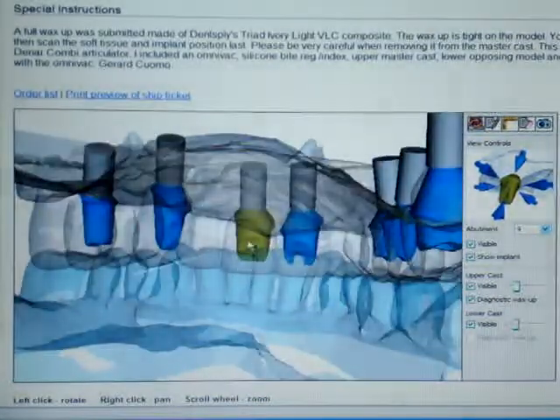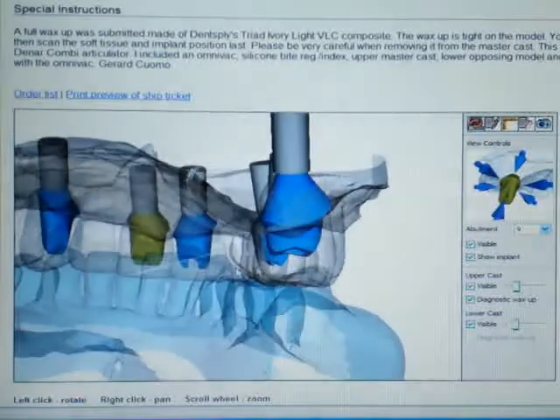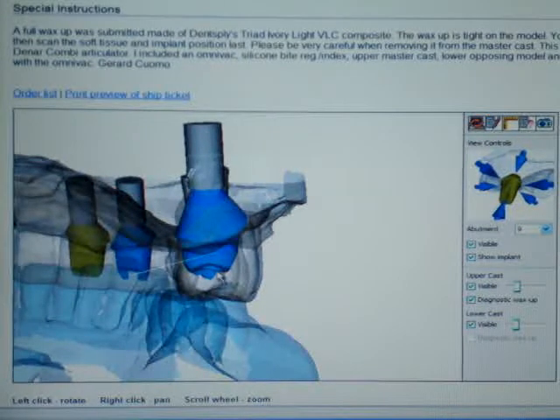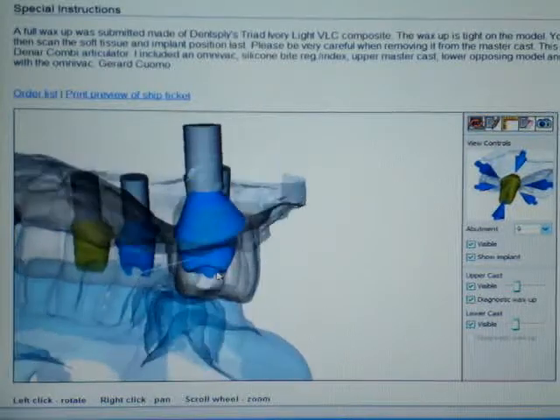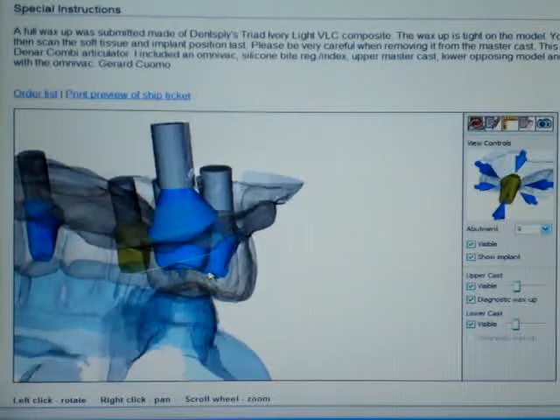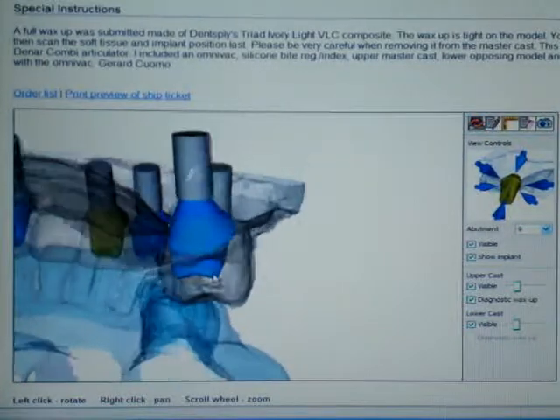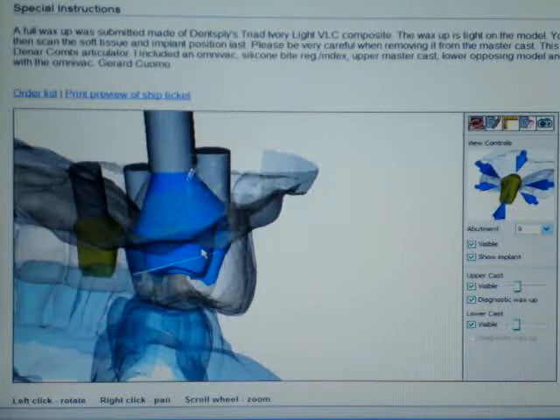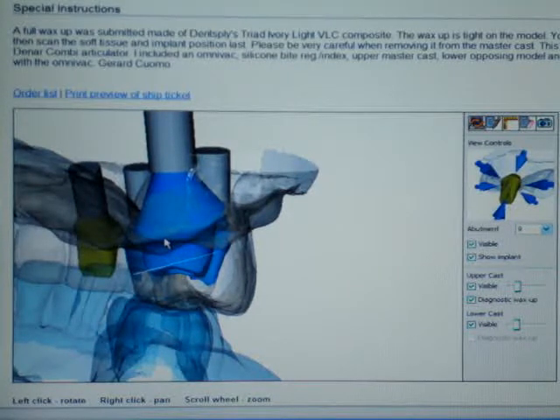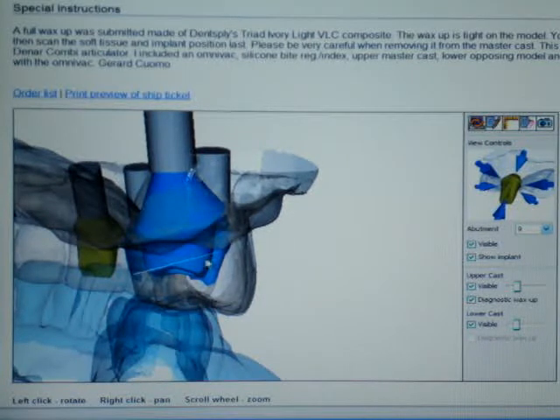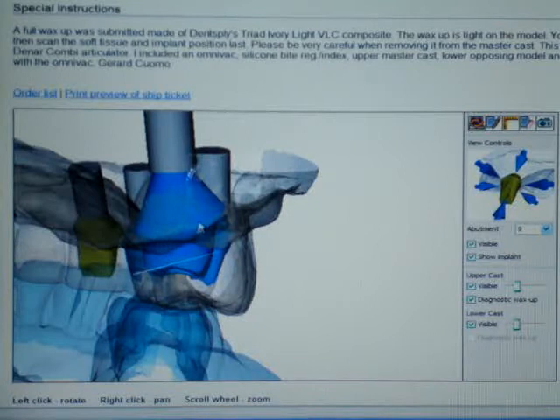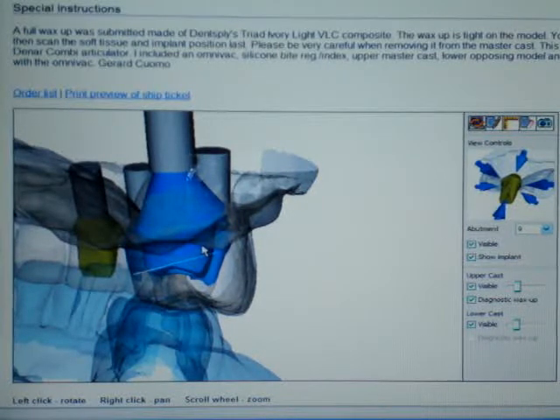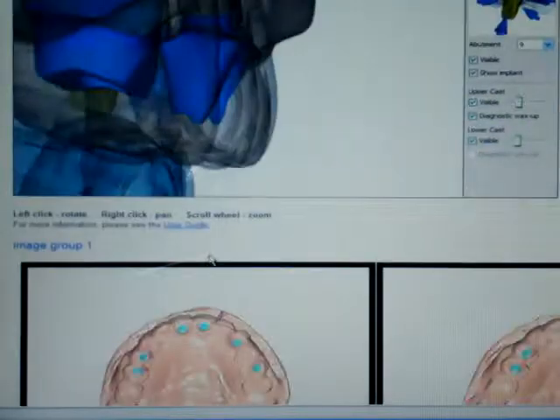And then let's go back to rotating. Now this is what I want. I'll pan this back. There we go. Now you can look right down the corridor. This is kind of neat right here. You can actually see how much buccal extension you have in your temporary. Let's blow this up now. This program's a little slow right now. But from here to here, that dimension. Do it buccally, lingually, and interproximally. Interproximal because you want to know where your cut-throughs are going to be.